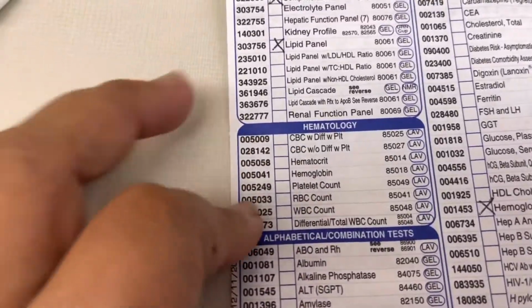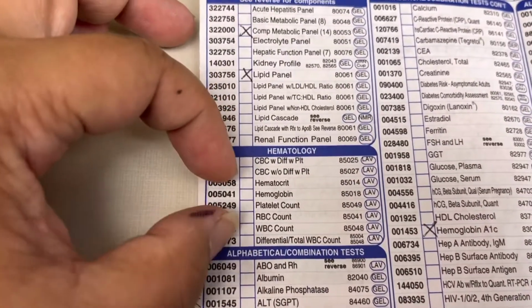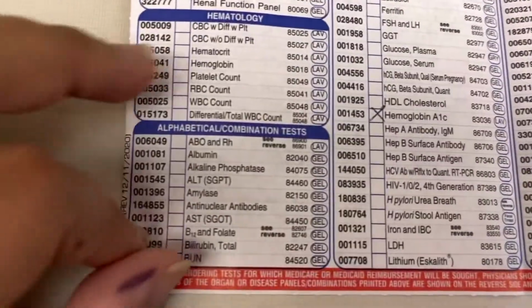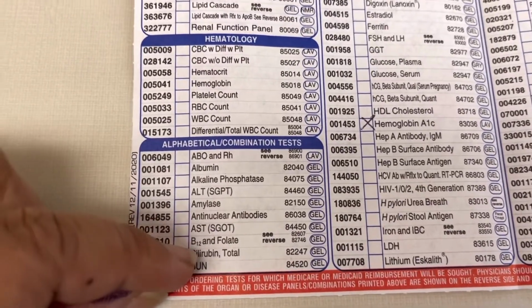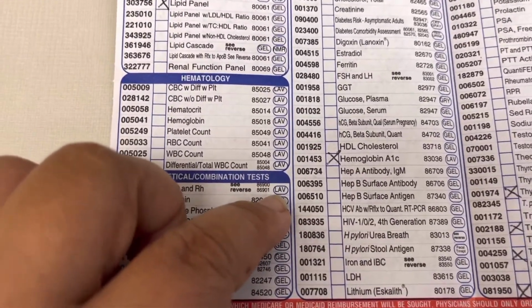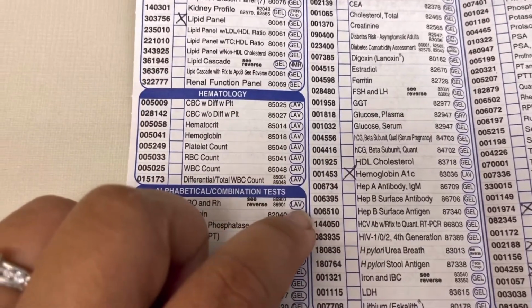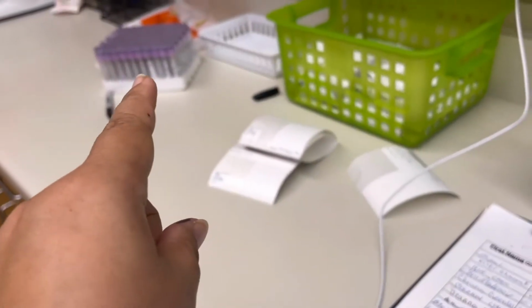All right, let's go to hematology. So in hematology, just try to remember all of these, most of these go in a lavender tube, okay? All right, these are other tests as well. This, like I said, is blood typing. It goes in a lavender tube, and this one is special though, okay? Because this one doesn't go in a regular short purple tube like that. It doesn't go on that. It goes on.